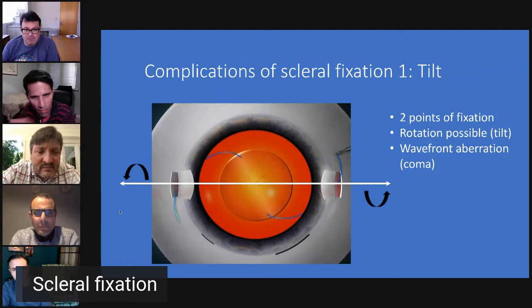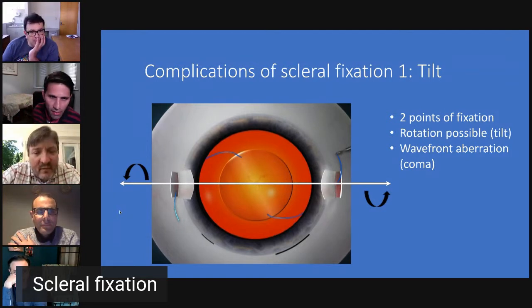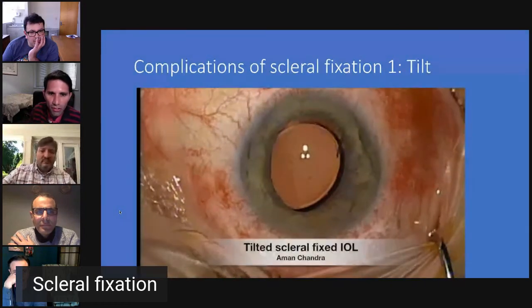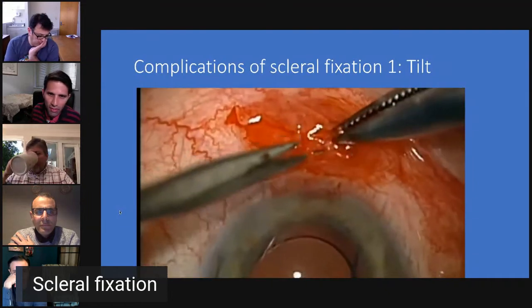So with these two-point fixations, I feel that there is always room for tilting along the axis of the IOL that's put in the eye. And when IOLs tilt, you get wavefront aberrations, usually coma aberrations, which if the tilt is enough, it is difficult or almost impossible to get the refraction, and it can be quite symptomatic. And so in some circumstances like this one, you do need to remove them. You can see that's significantly tilted.